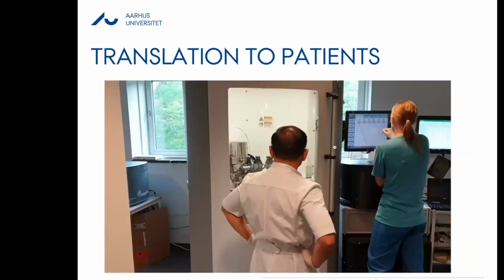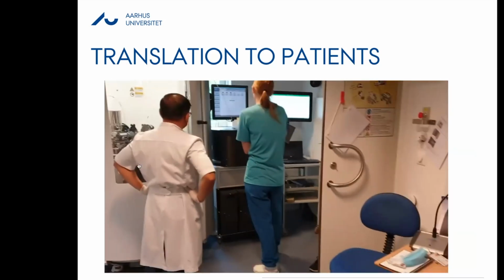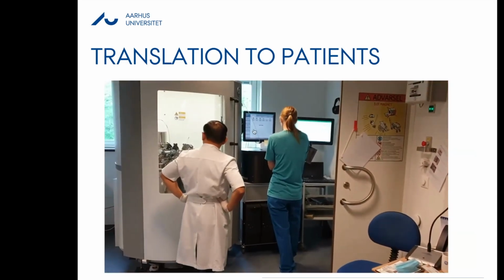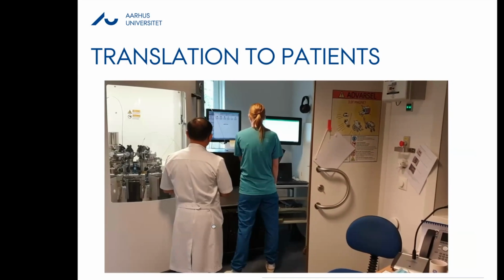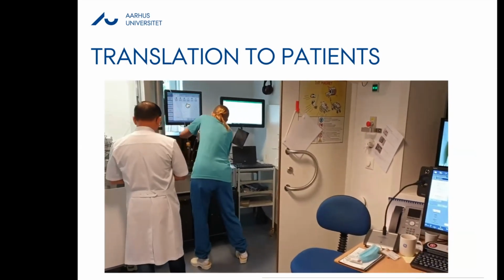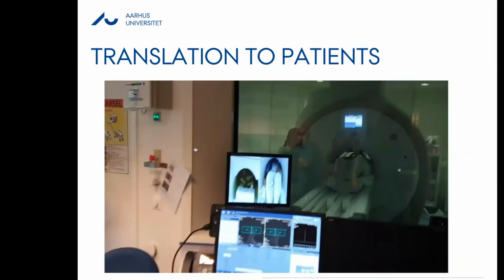Now, this has evolved into a clinical product, and this is the GE SpinLab. So this is in our lab. So this is Dewey and Mette, who's operating the clinical polarizer here. And so this is exactly the same procedure, and you see the signal, the dissolution has just happened, so it moves into the quality control unit here, and some tests are being done here, and you can get some readings out here to confirm that this is a safe to inject solution.